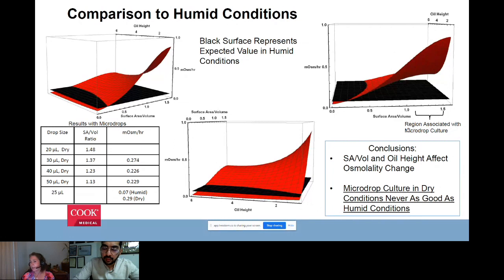However, now with the change of incubators, you find that a lot of the incubators, and I'm thinking more of the time-lapse incubators, have a fixed volume of media to oil. Yeah. If you use a dry incubator, you are always going to see a quicker change in osmolarity. So perhaps even changing the media at day 3 in a dry incubator is probably your best answer to this question, Shilly.